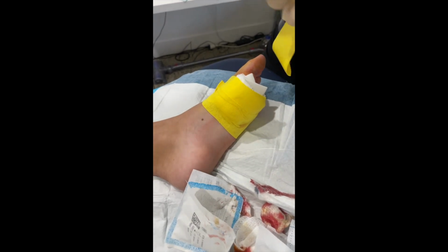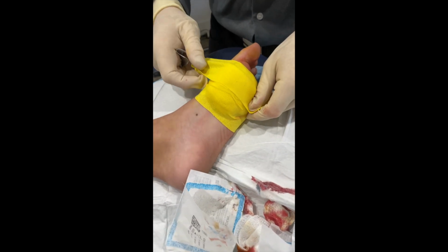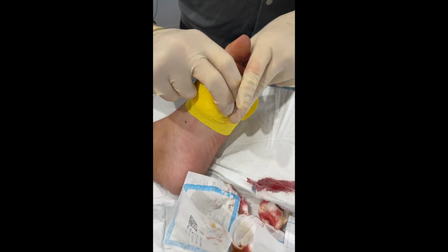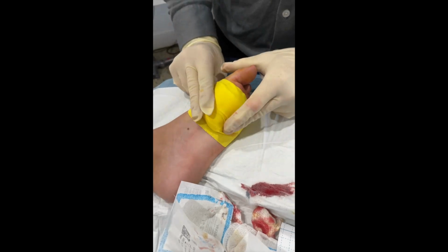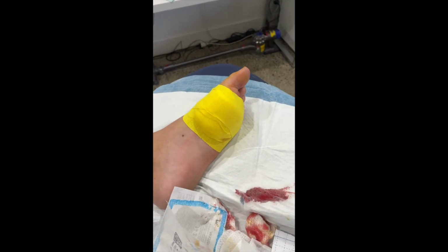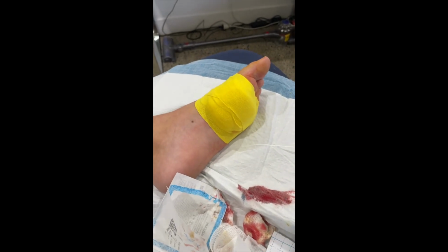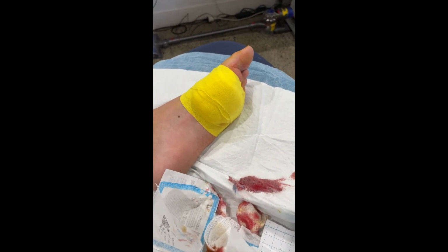Once we've got the tape on here, we ask the patient to then stand on it just to apply pressure to the bottom just to try and stop any excess bleeding. We then give them instructions how to manage this at home for the night, and we'll get them back in tomorrow for a review and change the dressing.